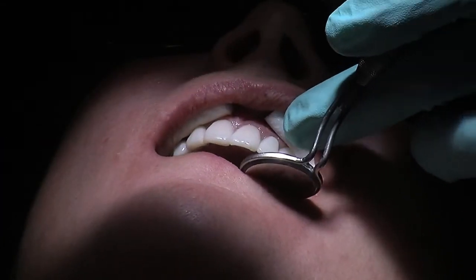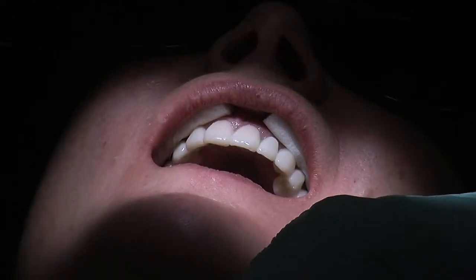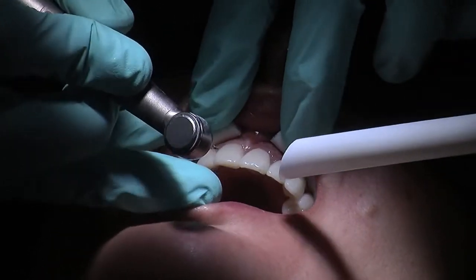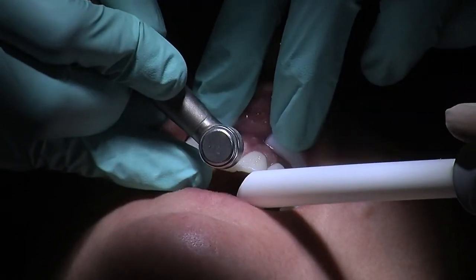Then I'm going to switch to the fast handpiece using this flame-shaped burr, very thin burr. Have some suction please now. A little bit of gentle drilling now. I'm just adjusting the temporaries slightly, okay? So close slightly. So a little bit of drilling.